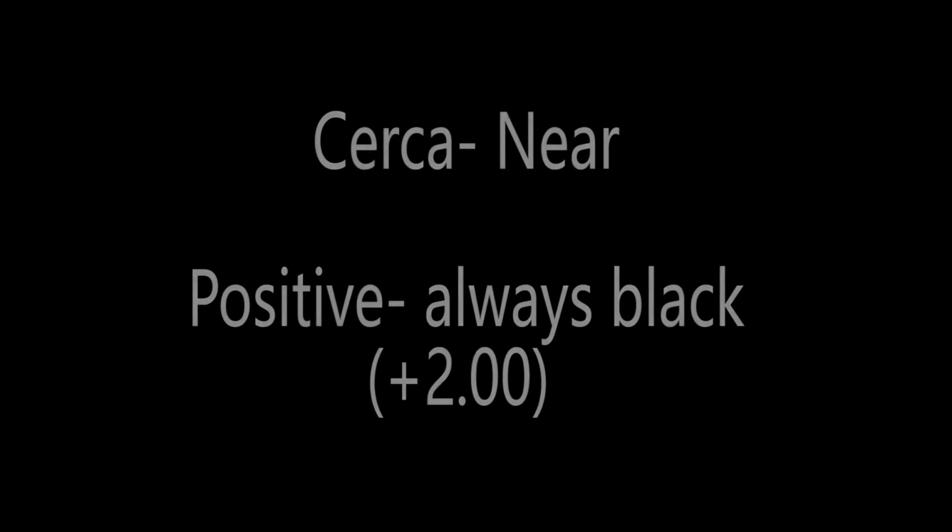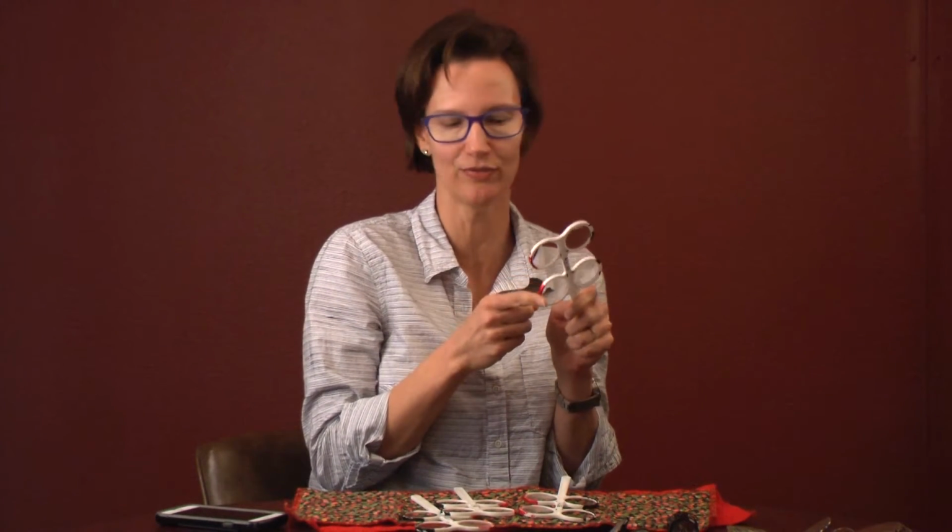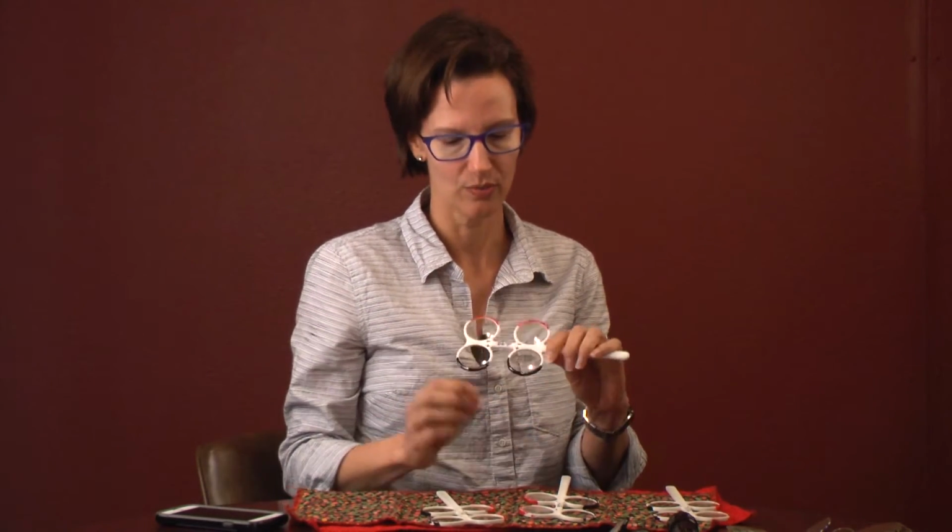Let's switch to the near. If somebody comes in and says, I can't see up close, it will always be positive. It'll always be black. Do not try to show somebody a red negative lens for reading. It won't ever work. It never makes sense. And if you insist that a patient needs negative, you're messing it up. So we always start with the positive for readings. I always start with the positive 2, the black positive 2.